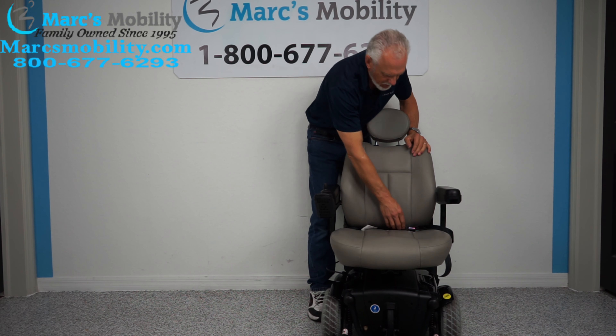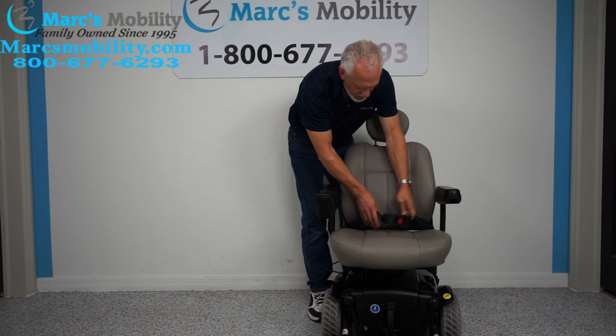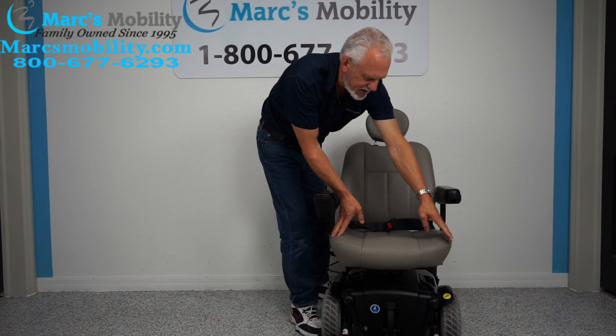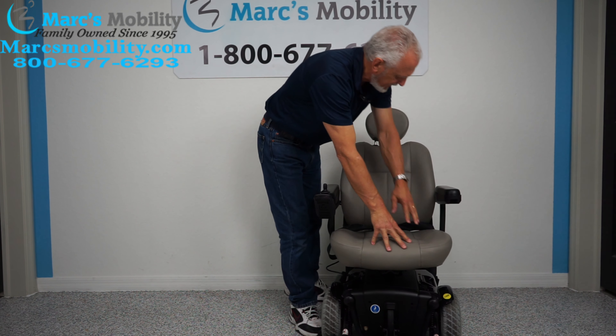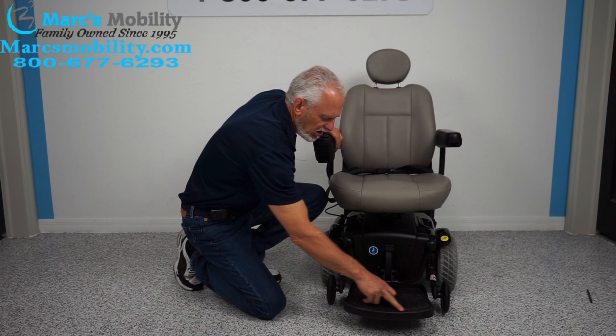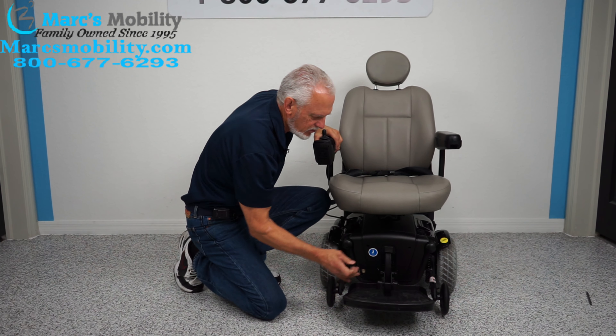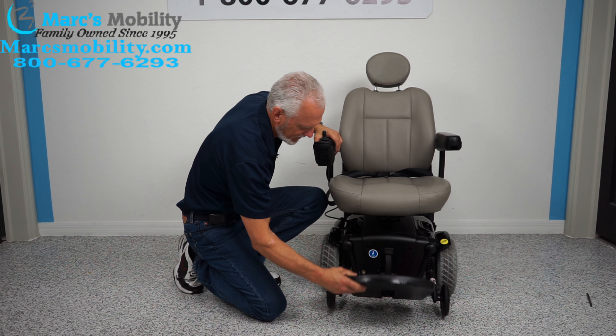The chair will drive with the seat elevated, but it'll drive at a much lower speed. The seat has to be all the way down to get your full speed back. This chair will go four to five miles an hour, but the seat has to be all the way down — there's a sensor in there.